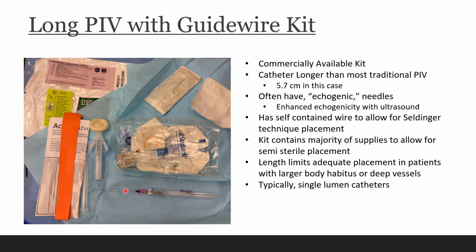And then lastly, as far as dwell time, these have pretty good dwell time compared to the traditional catheters. Seen them quote some literature where they did a local study where these seem to be functional up to like 13 days after they were placed. So the longer they're in, increased risk of infection, and they certainly can't dwell for as long as a midline catheter or a PICC.